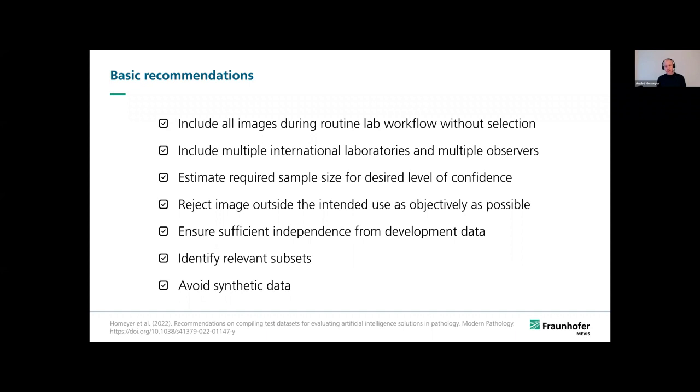There are several studies that show that AI methods are prone to exploiting site-specific feature correlations in datasets. And in this case, performance metrics on a test data set that comes from the same clinical site may overestimate the performance in the real world.